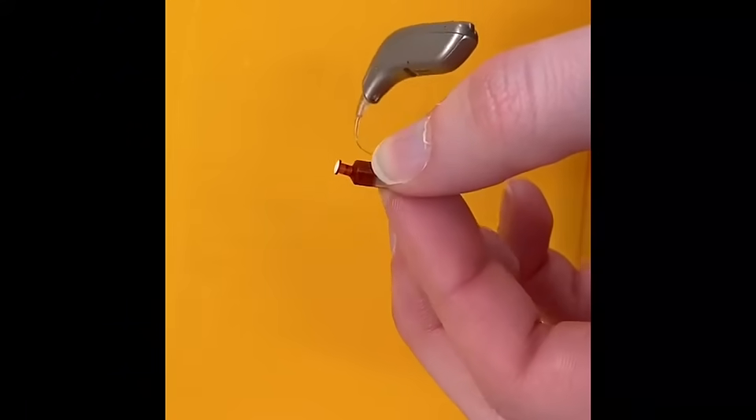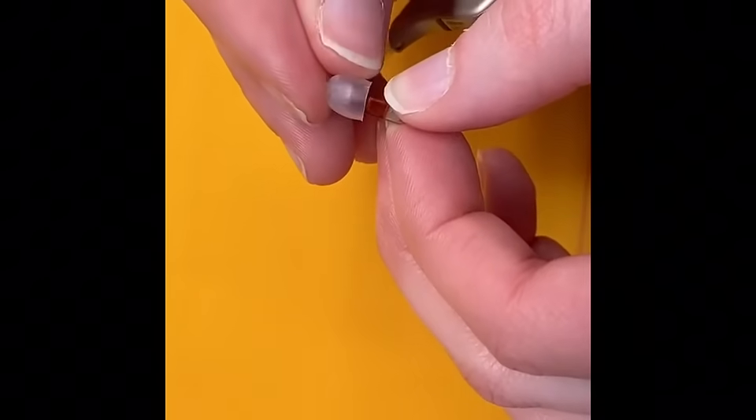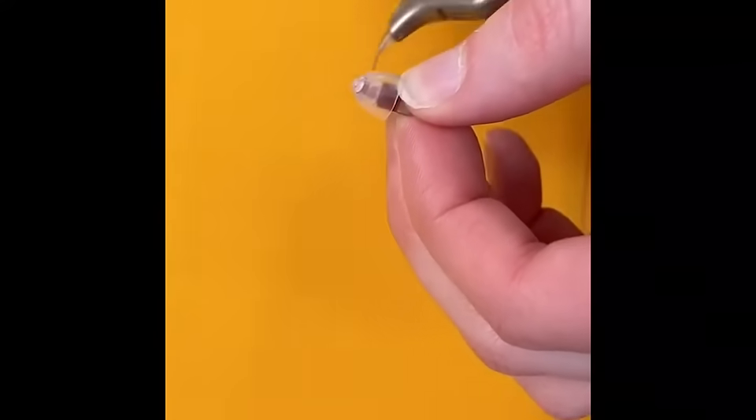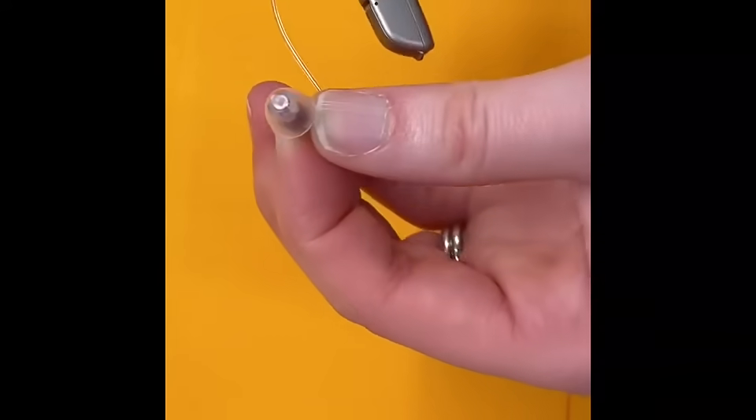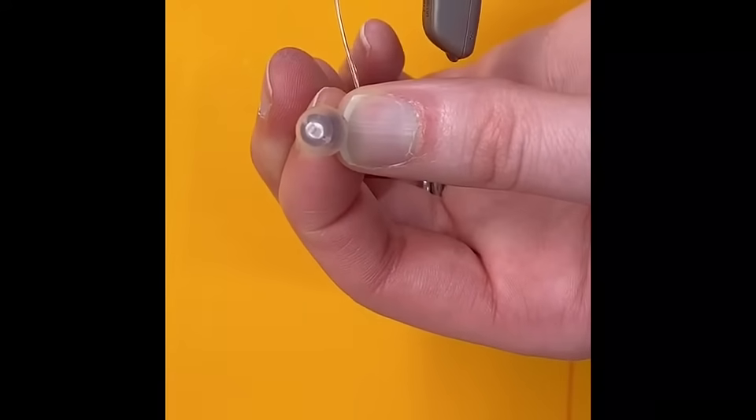To get it back into place, line up the circle with the receiver and push it on. Once you think you have it on all the way, push on the top with your finger to make sure it's fully in place.